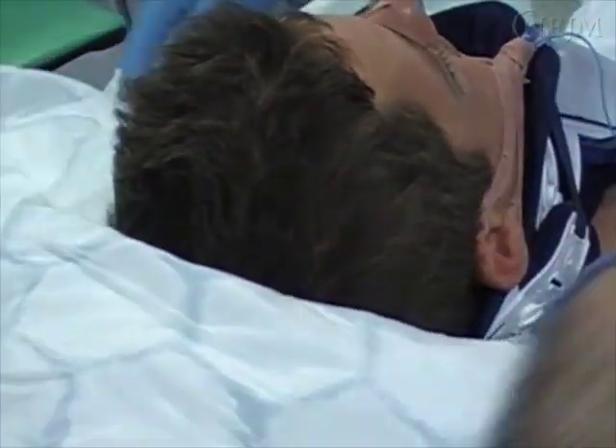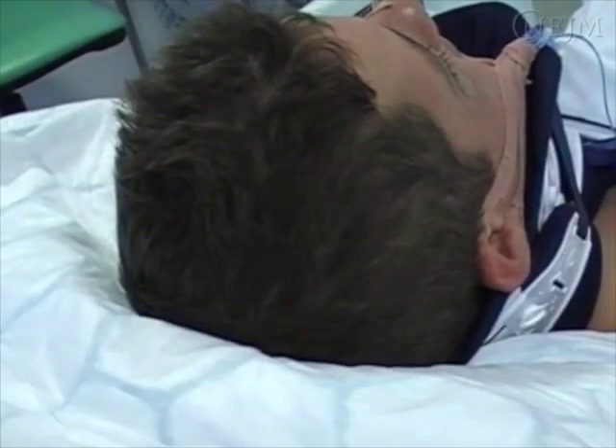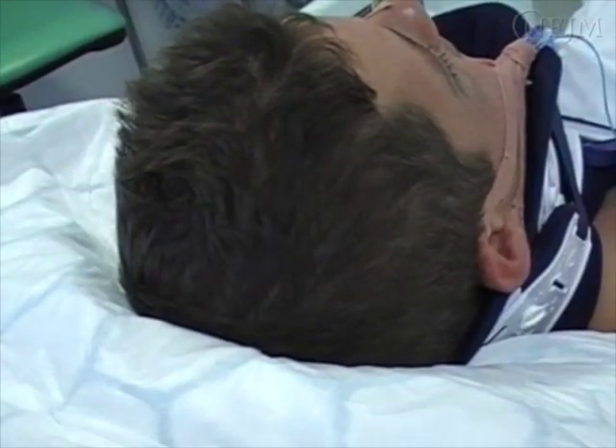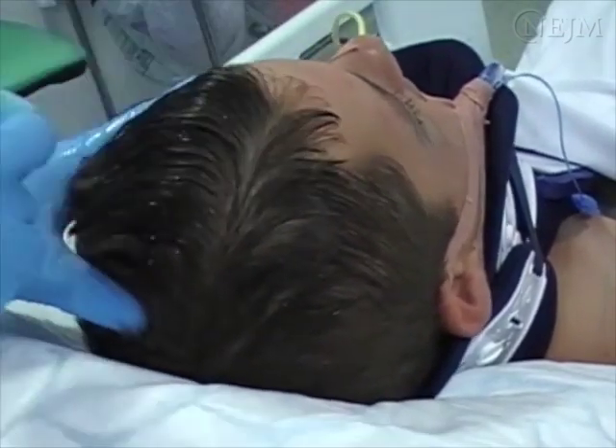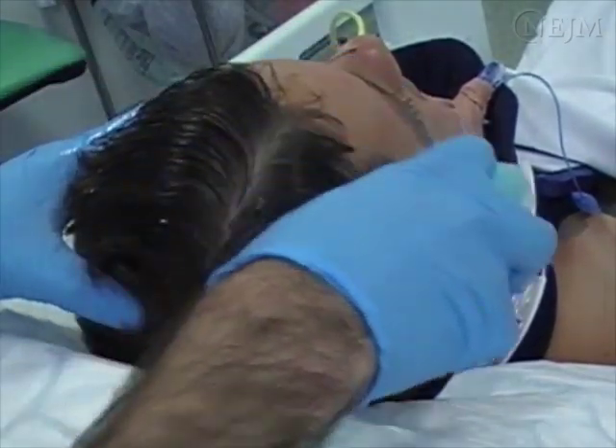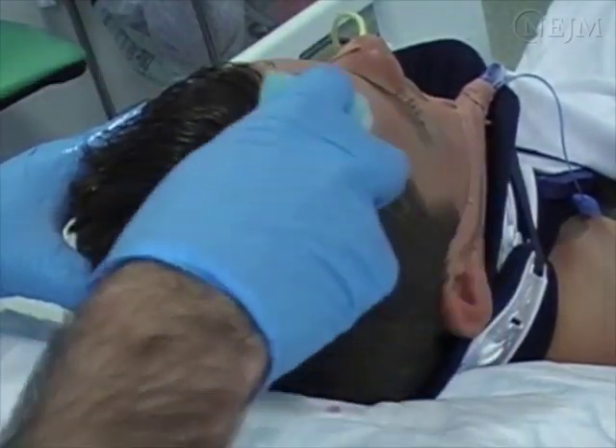Don non-sterile gloves. Place the patient in a supine position and put the water-absorbent underpad beneath the patient's head with the plastic side down. Wash the patient's scalp with soap and clean water using the washcloth or brush. Dry the skin with a hand towel and shave as necessary.